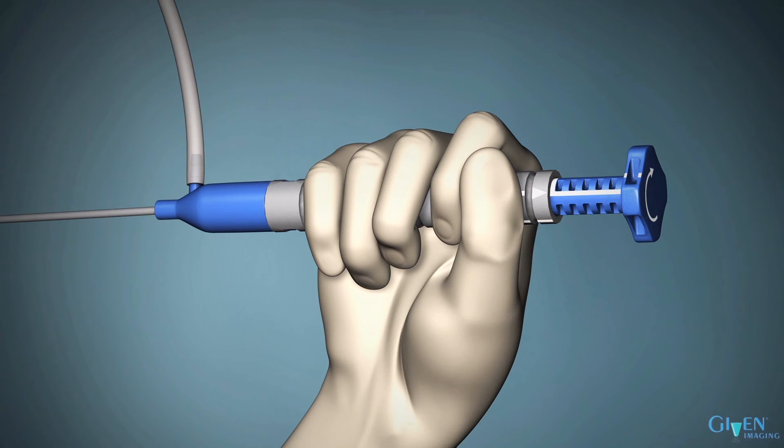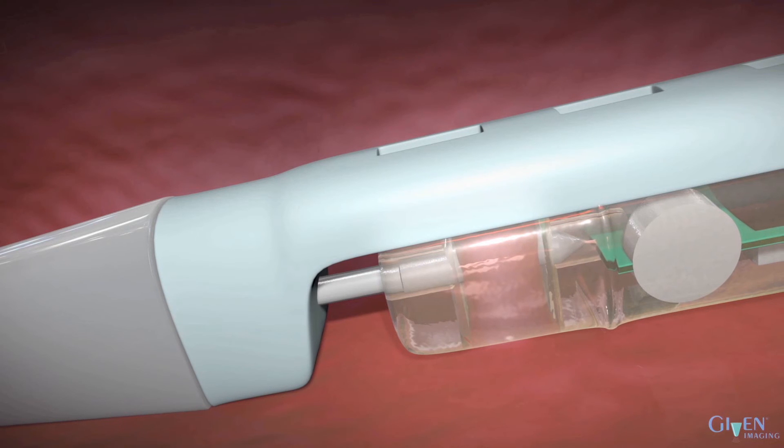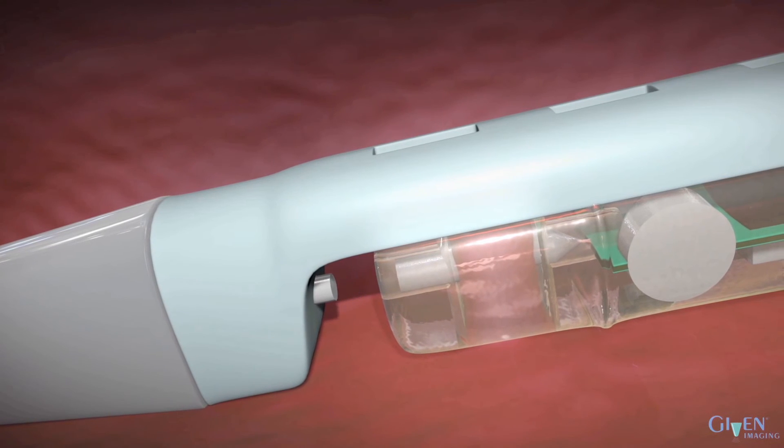The plunger springs back so that a white line is visible on the sixth rib of the plunger. To ensure that the plunger has sprung back completely, or if the white line is not visible, use your thumb to raise the plunger until the white mark is visible. These steps will release the capsule from the delivery system.